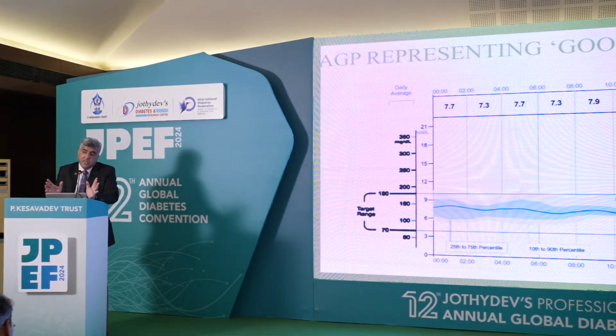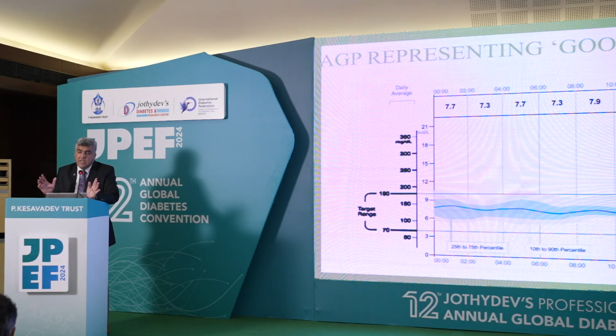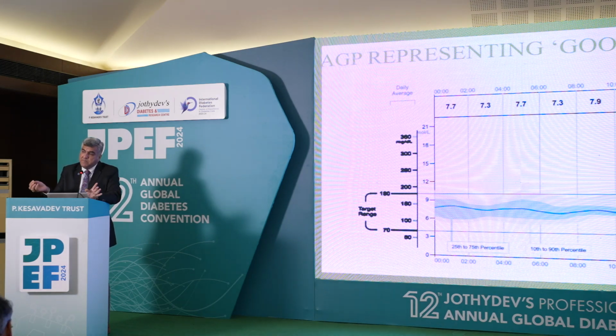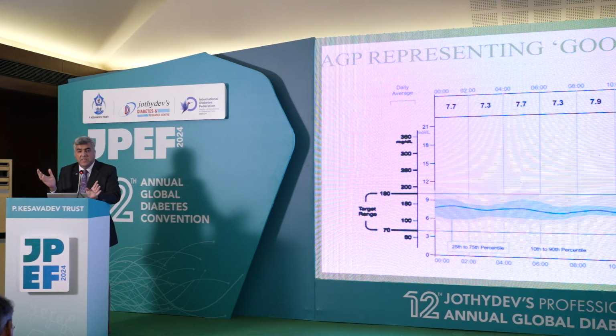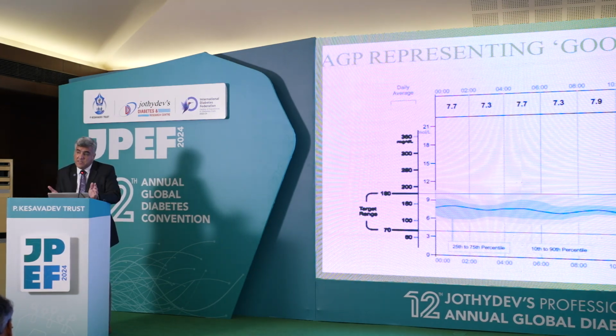So what for years we never realized was the glucose movement. Right? We continued to manage diabetes just by looking at bare numbers. One fasting, postprandial, maybe one HbA1c, which, across the country, for cost issues, not every patient does. So how do you manage diabetes? You manage on one fasting and PP from the laboratory, you manage on some SMBG, but we were missing the point.